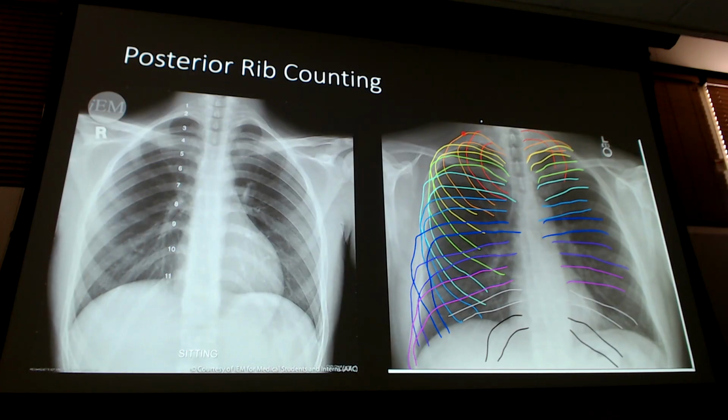So part of the reason you see fewer anterior ribs on the x-ray is the projection, and then as you get further down, they turn into more cartilage. There's still ribs up here, but then they shift more. All of this is cartilage down here in your 9 through 12. That then comes up into more cartilage up into the sternum. It's right about here. That's the costochondral space. We'll talk about that later with costochondritis.